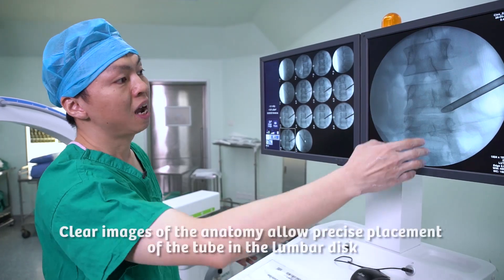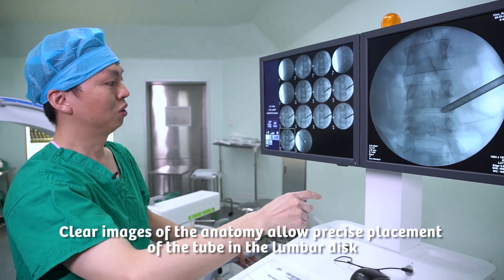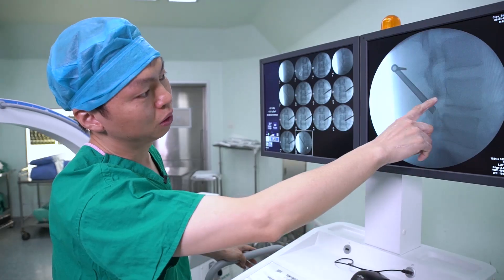At last, we have to put the tube — the working tube — into the disc space. Now you can see, with the clear image, we can see the positions of the tubes in quite a good position.